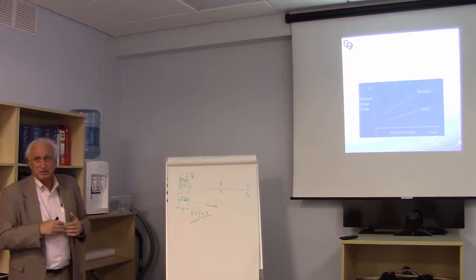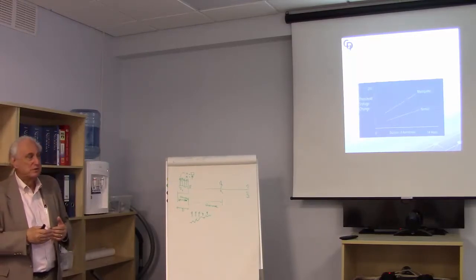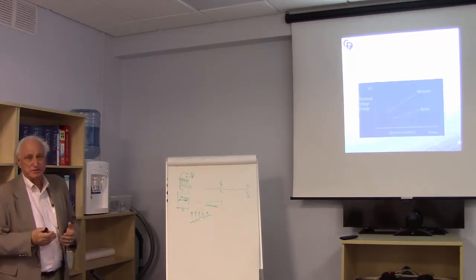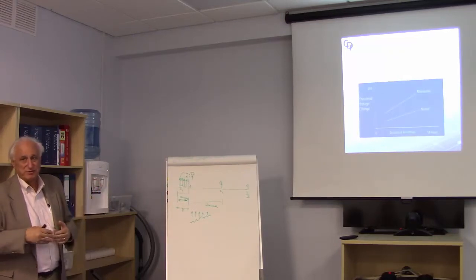How you manage it is going to be based on your experience and the kinds of operations you do. But be slow to adjust the stimulus parameters based on these kinds of changes, and don't expect to see this till a number of hours into the operation.